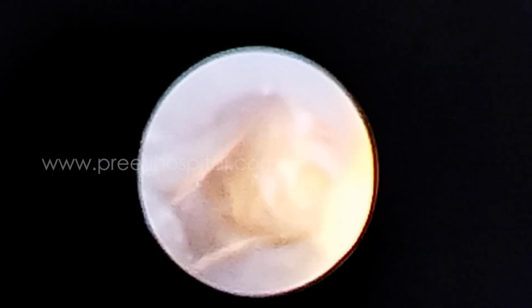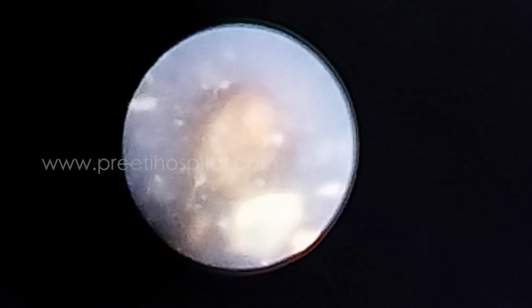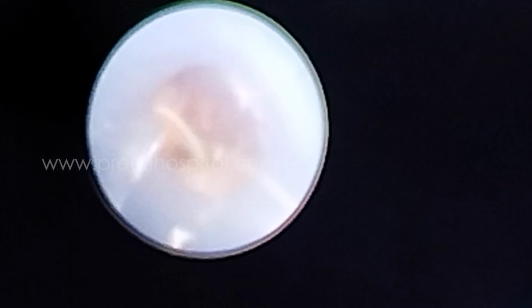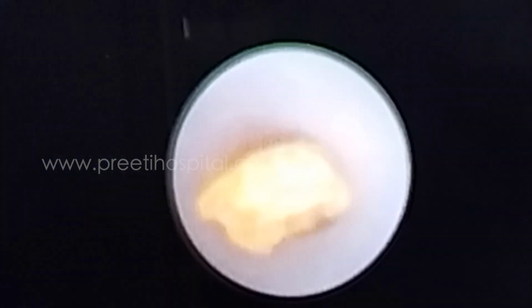In this case, if the calyx is not delineated, what will you do? You inject the contrast and then repuncture if you want the proper tip of the calyx. You got the point of what I am telling, Karthik? Yes, sir. Like in ultrasound guided puncture. In this case, ultrasound we have not done. See, this is a disadvantage of the pneumatic lithotripter.